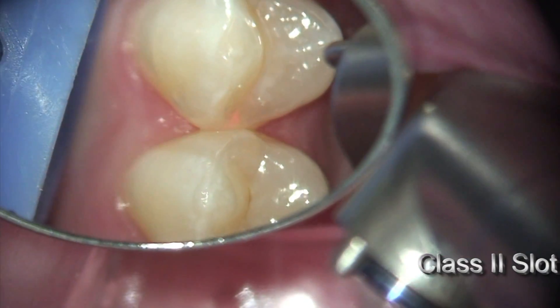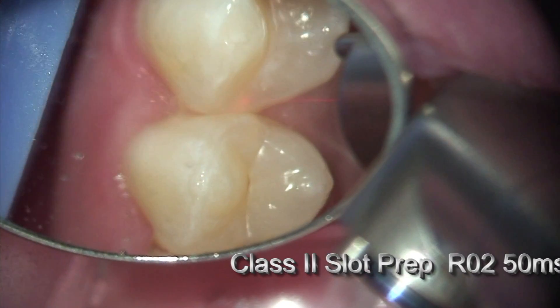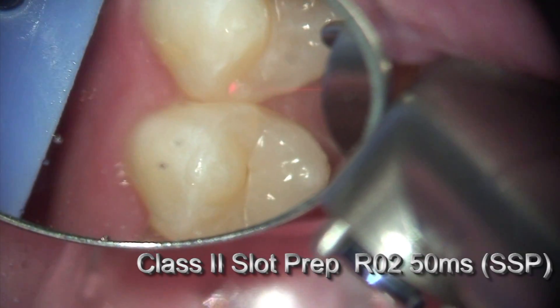Here at a Class 2 restoration, I'm going to create a Class 2 slot preparation — again, minimally invasive.